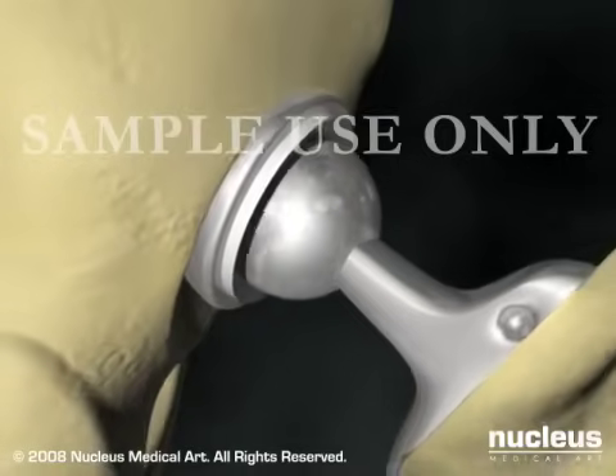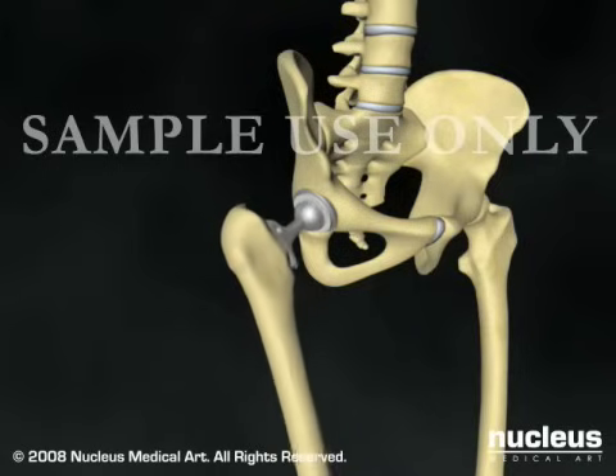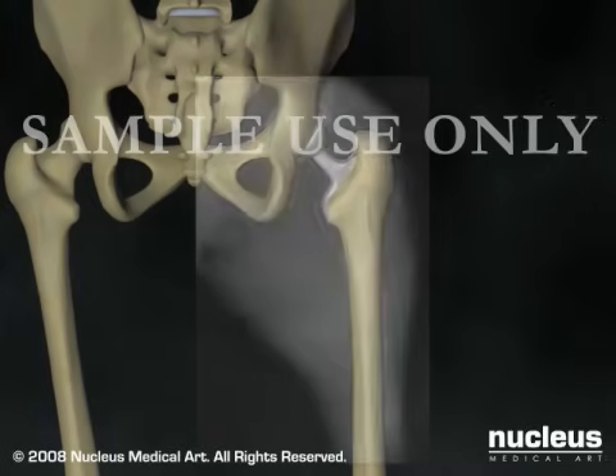your surgeon will slide the prosthetic femoral head into its acetabular counterpart, test the movement of your new hip joint, and verify that it is properly positioned with an X-ray.